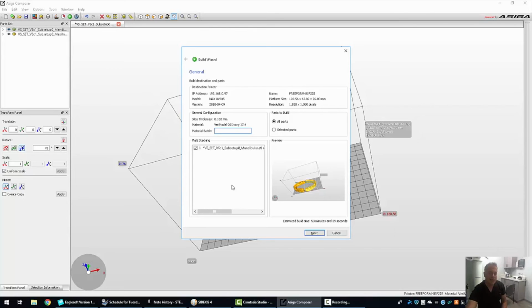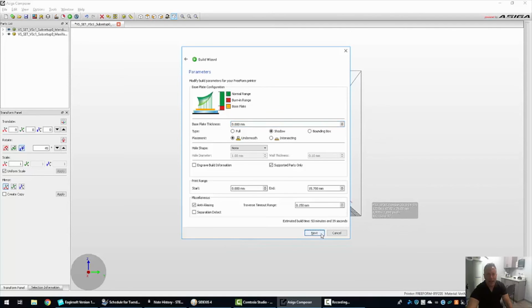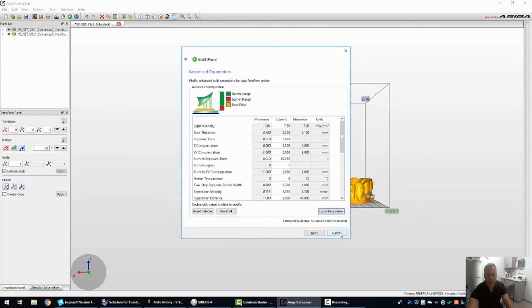So you can see here it's going to take us about an hour. We can put in batches of our resin to make sure that the resin is working well. I think it's pretty unnecessary. It's going to ask us, do you know that you're not having support structures? You hit continue. And now you can finally go ahead and print.